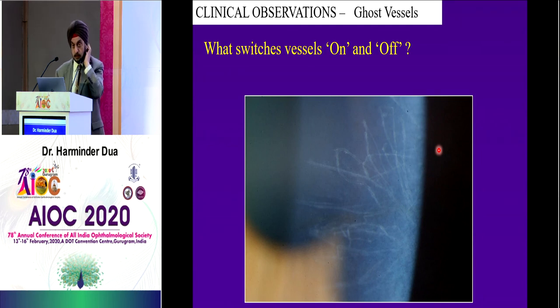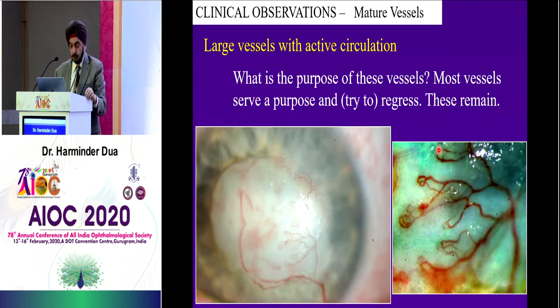You see like this, these are the ghost vessels, white lines. But the thing about ghost vessels is when the stimulus comes back, they recanalize. So they're not like they're gone forever. They are capable of causing problems.